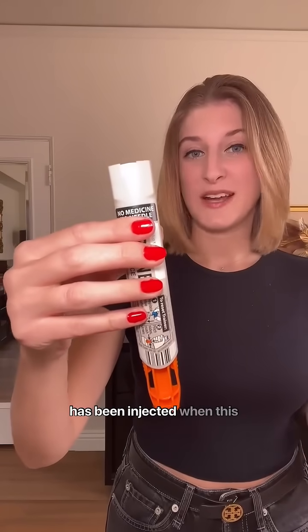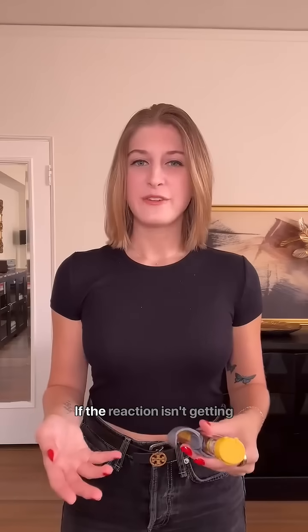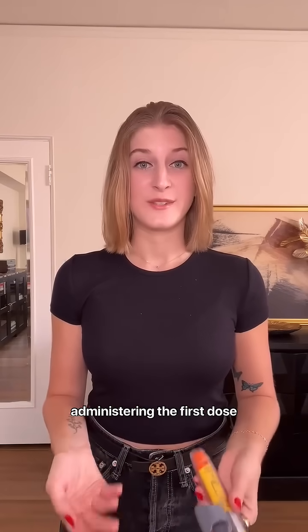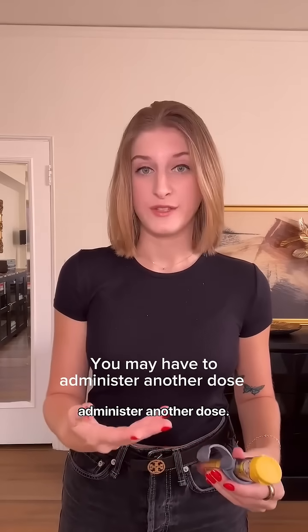You know the epinephrine has been injected when this orange tip is extended, because it's covering the needle. If the reaction isn't getting better or it's getting worse within 5 to 15 minutes after administering the first dose and the paramedics are not with you, you may have to administer another dose.